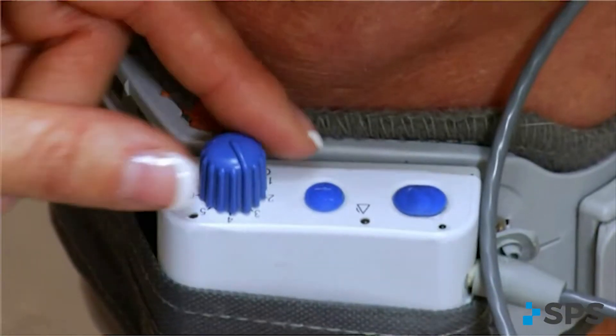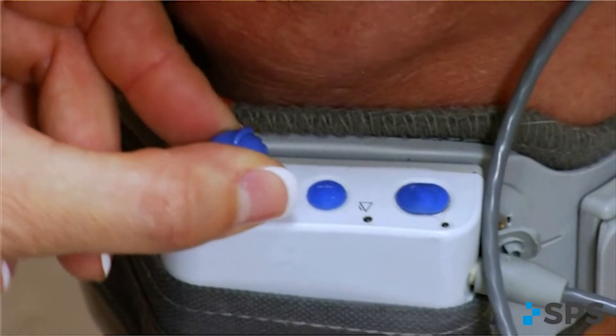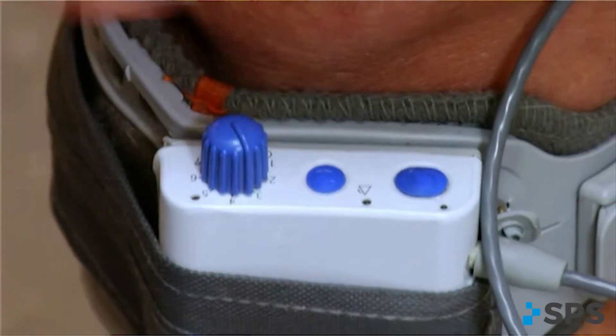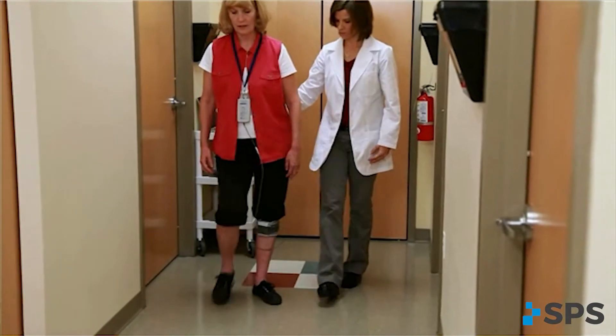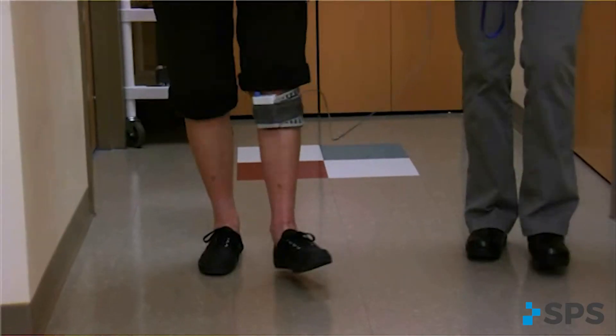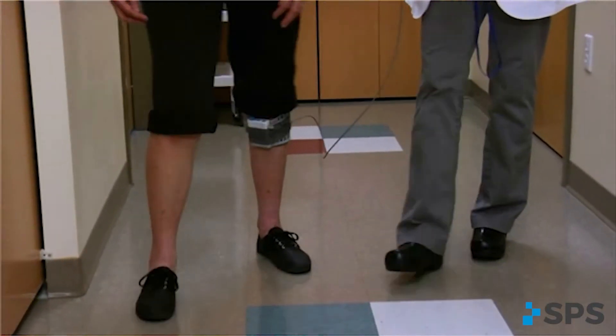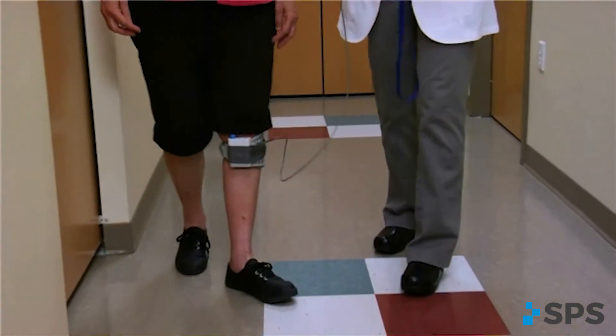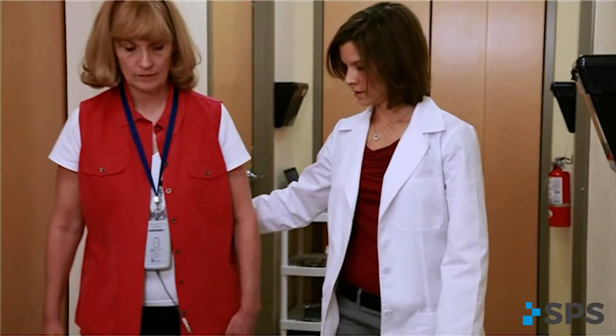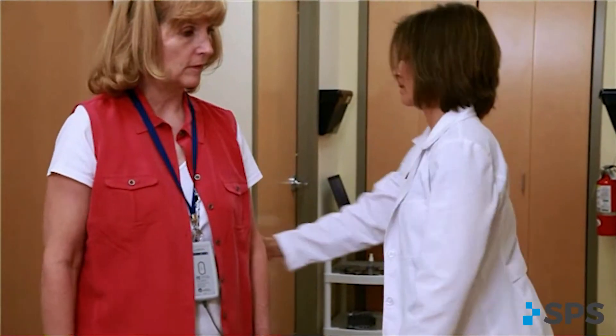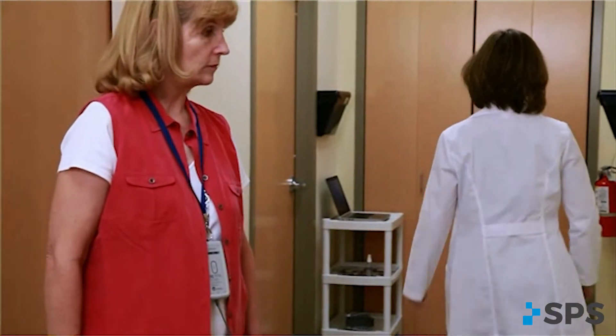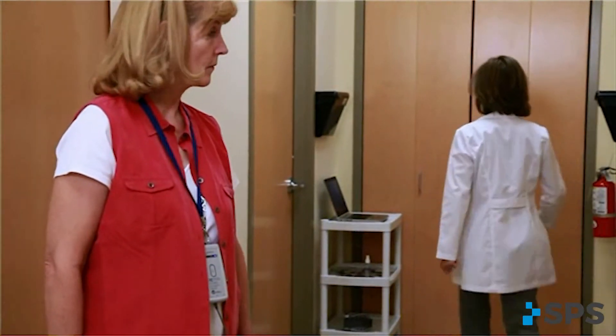To deactivate the audible beep, simply turn the WalkAid off and back on. Ask the patient to walk. Watch the patient walk and listen for audible beeps, which indicate that the stimulation is occurring. Ensure the patient is not at risk of falling.